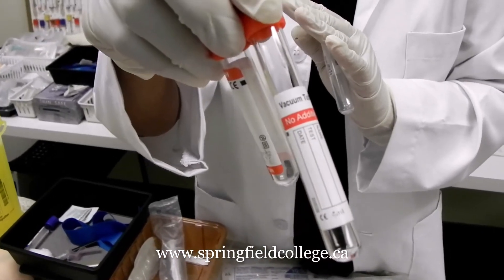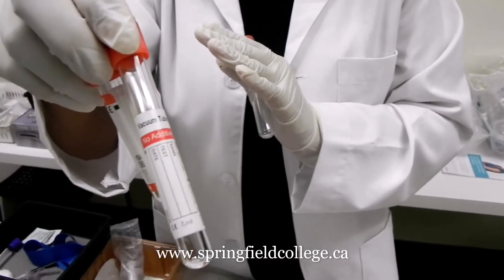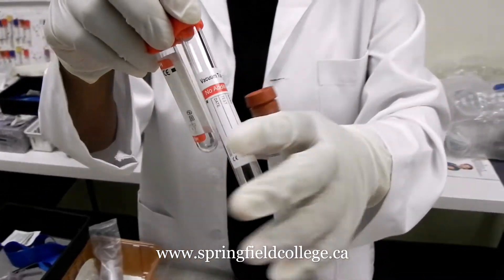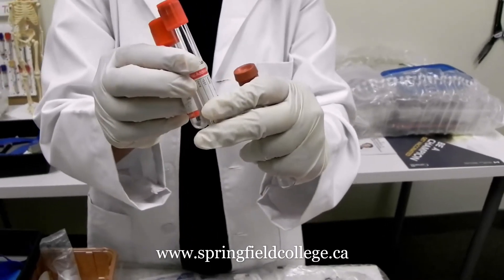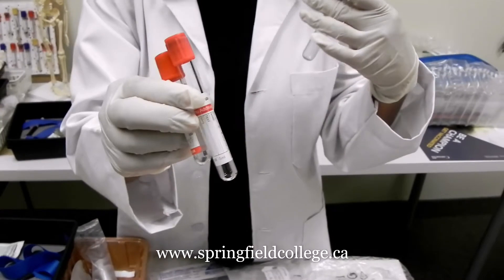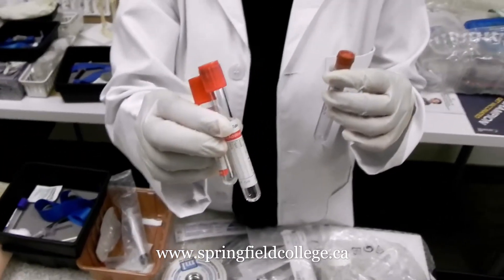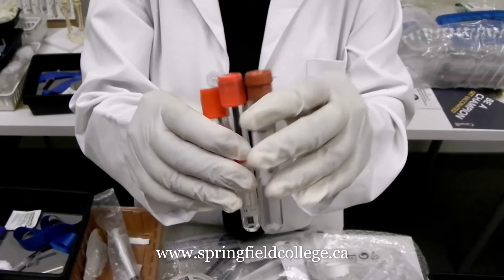We use the serum tube for toxicology, serology, or similarly for immunopathological studies — in cases where the patient is suffering from common cold or hepatitis. We can use this tube for those purposes.